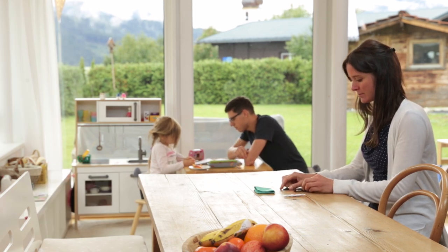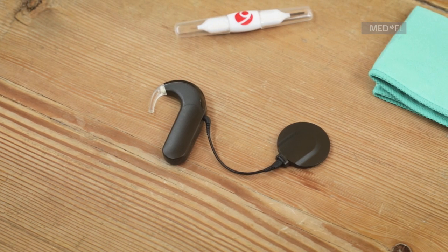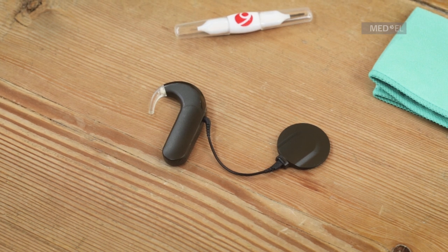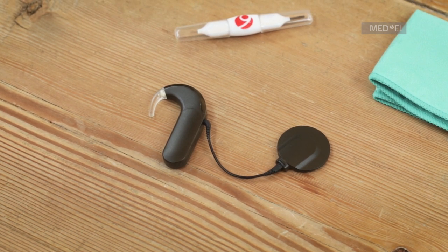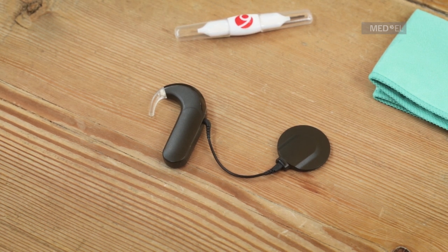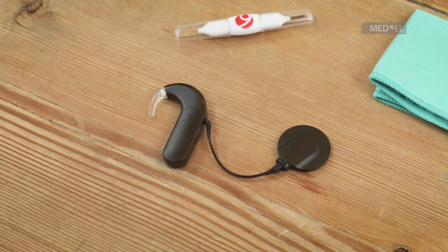If you encounter any minor technical problems, such as an interruption in sound, there are some steps you can follow to identify possible causes and solutions. The first thing you should try is changing the batteries. If that doesn't solve the issue, then disassemble your sonnet.